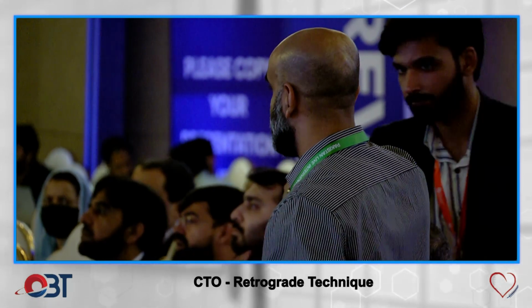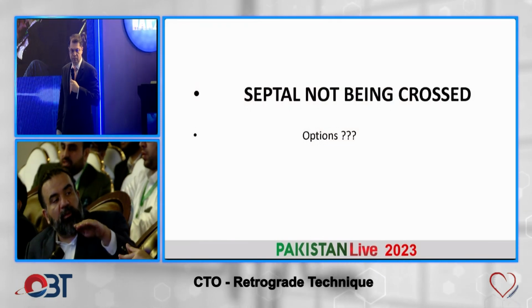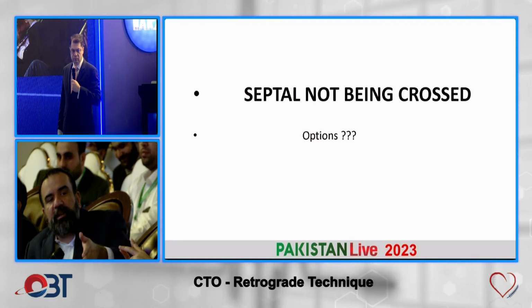It's classic. So I always start off, if I think of retrograde to the septals, I will do an LAO cranial and an RAO cranial. So I do those. Sometimes I will actually go outside of the room to the monitors in the monitoring station, because the way you look at the septal is you pause the image where you see the target vessel, and then you click backwards to see what filled it. Right, so which septal to use? Because if you just look at the picture, in real time you can't see, you have 20 septals coming down.